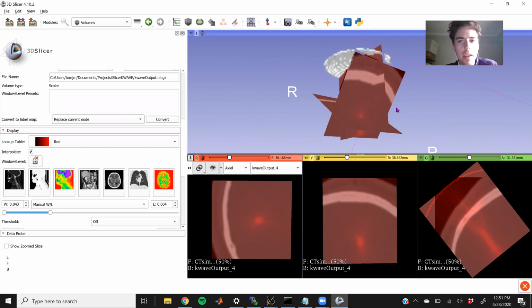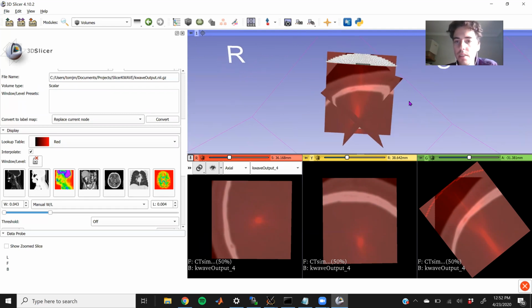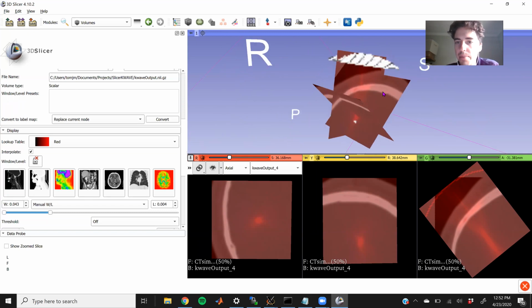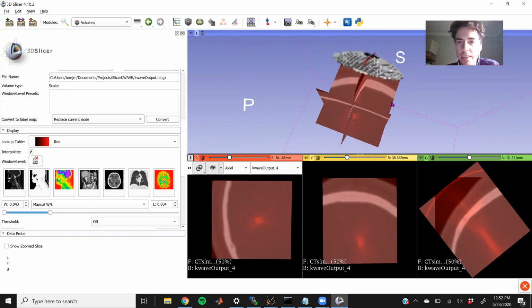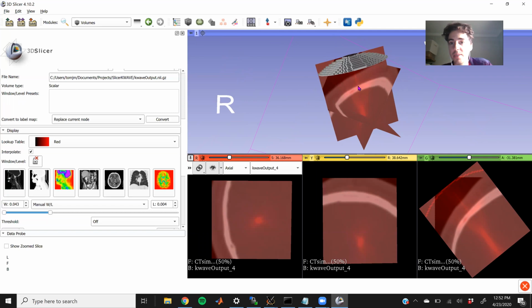So that is the general process. It's still under development, but I think that gives a picture of the steps that are taken, and also probably the areas where it can be improved. All right, that's it.